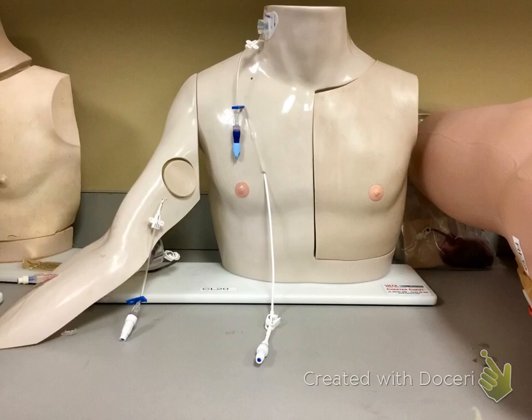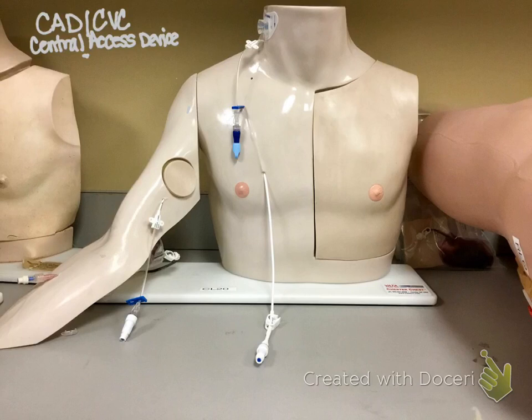So first, I want to tell you exactly what it is, what are we talking about? We're talking about CAD, or central access device, or sometimes referred to as a CVC, which is central venous catheter. And then often you may even see it written as a CVAD, which is a central venous access device. However you see it put, all of these are a central line. It's a central line that sits right outside the right atrium. So you may see it referred to as different things, but a central line is a central line. And that's what we're going to talk about.